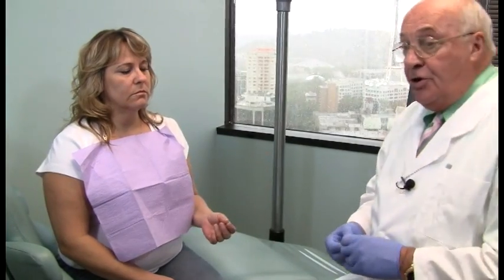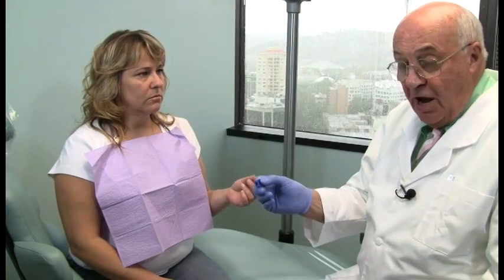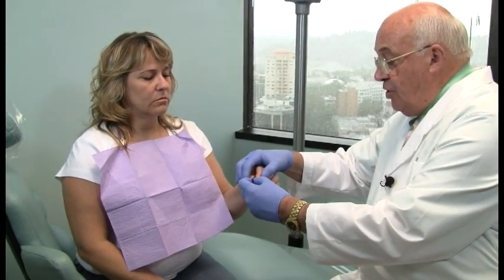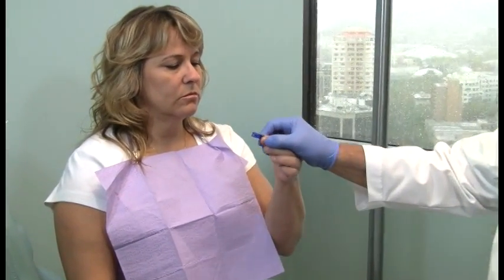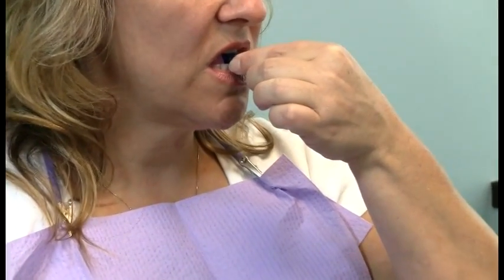One nice thing about these little simulator pieces is that it's very easy for patients to put these in at the designated positions and be a participant in this, which I have found helps with their awareness and involves them more in the evaluation of their sleep apnea and what solutions may be best for them. So right now I have a simulator chip that has the end-to-end 4 and 6 millimeter, and I'm going to position this so that when this is turned around at the designated second notch, she's going to be end-to-end at 6 millimeters.